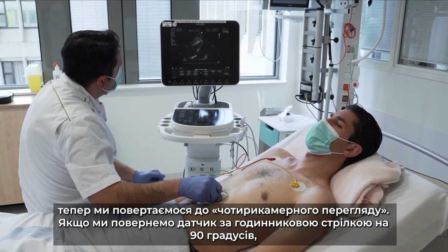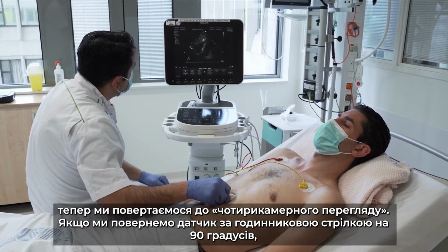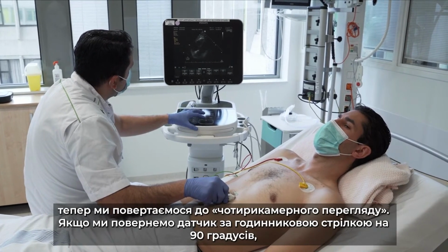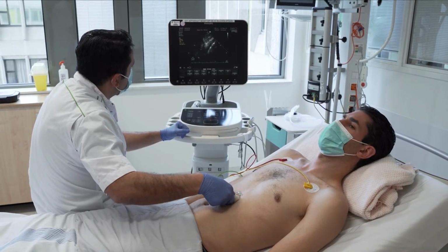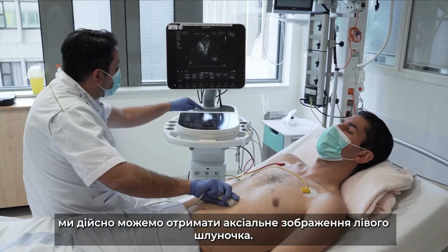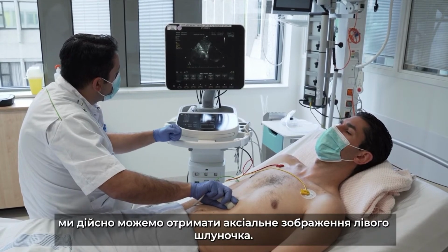We are now going back to the 4-chamber view. And from the 4-chamber view, if we rotate the probe clockwise 90 degrees, other side, I think, Zakir, we can actually do axial windows, axial views of the left ventricle.